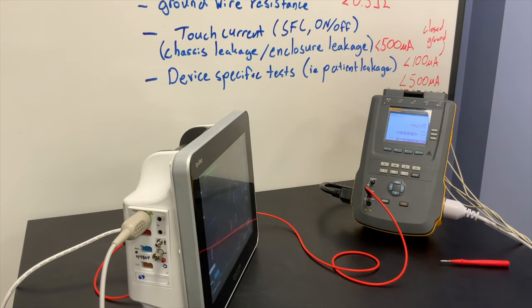We should expect to see leakage current creep up a bit as I open that earth. For lead to ground in normal polarity with open earth, we need to be less than 500 microamps. When I close the earth, we need to be less than 100 microamps. Both of those are well below what we need to be at.